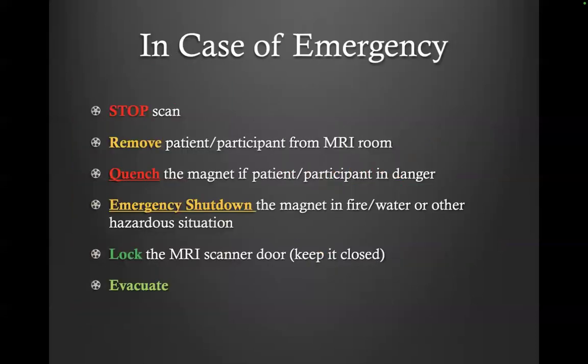So again, emphasize, in case of emergency, you stop scanning, you remove patients and participants from the MRI room, you quench the magnet if patients or participants are in danger, and you emergency shut down the magnet in fire or water or in other hazardous situations.